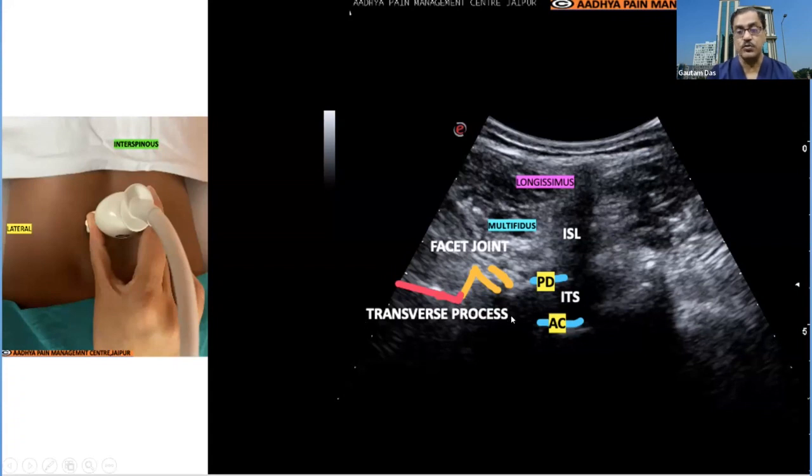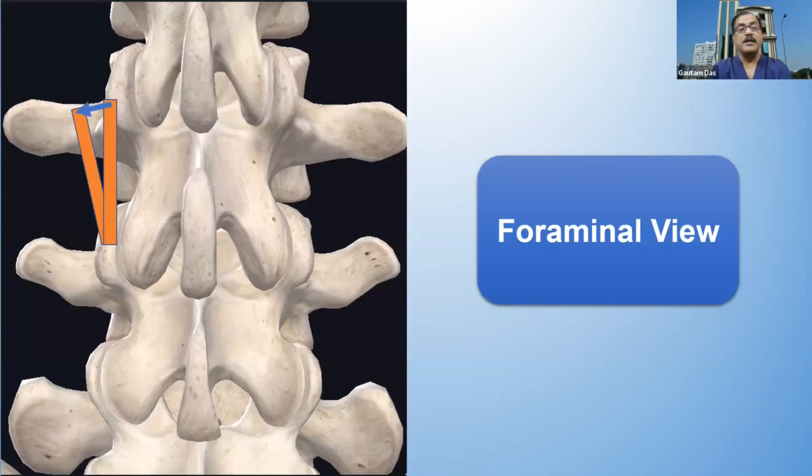So again, we'll be showing that things. And this one is a foraminal view. I'll be explaining it when we'll be showing the volunteers.